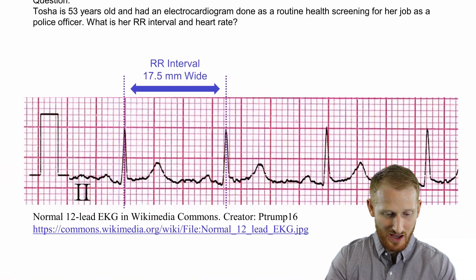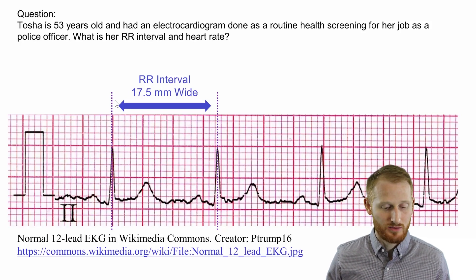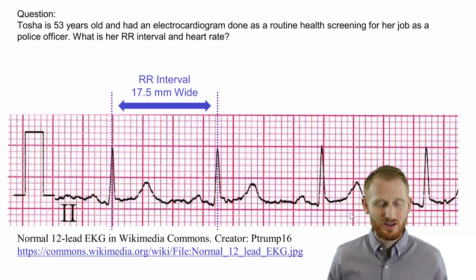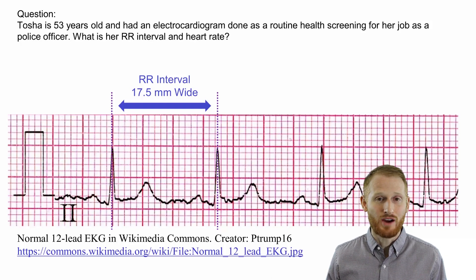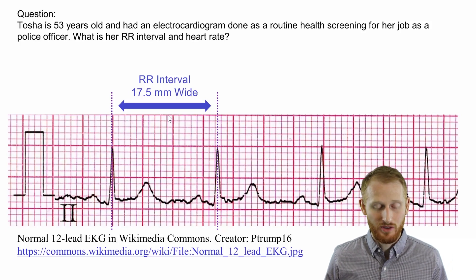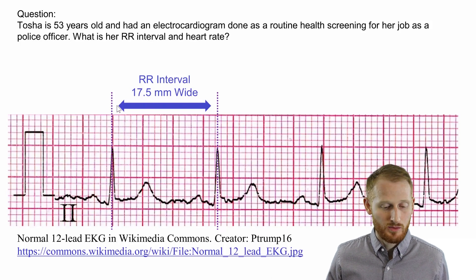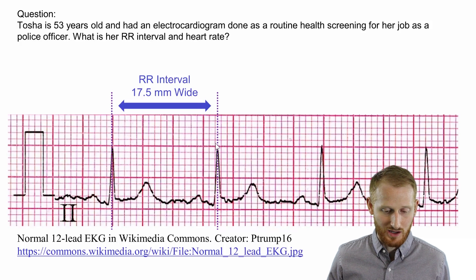Let's use this as an example ECG. We have an R-wave marked here by this dotted purple line, and another R-wave here, plus a couple more R-waves we could have used. To be most accurate, you would want to do this for multiple R-to-R intervals to get an average value, but let's just do it for one. The distance from this R-wave to this R-wave — counting these tiny red squares — gives us 17.5 millimeters, since each square is one millimeter.